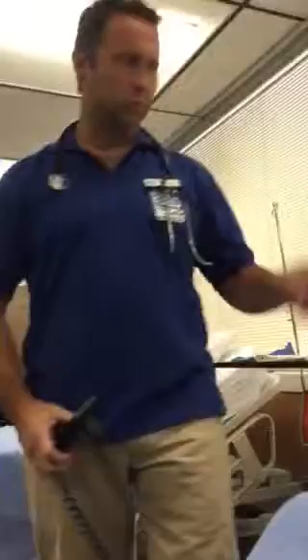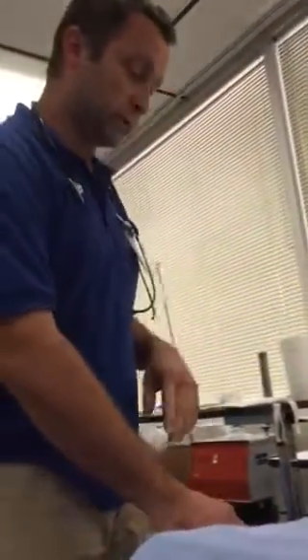All right, so we're back, and we've received orders to give this patient an NG tube. We're going to apply suction, intermittent suction is why we're NG tubing him. What we want to do is come in here and do the meet and the greet. We're going to do the two patient identifiers. Name, date of birth, please. And he's Mr. Rothson. He is who he is.